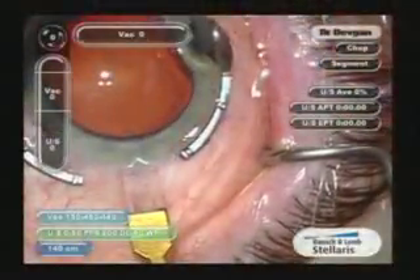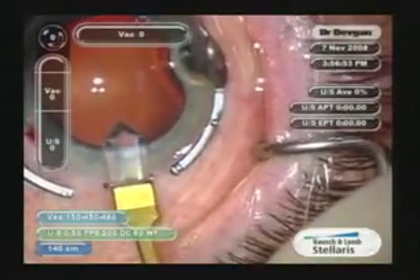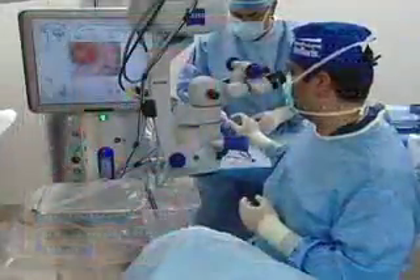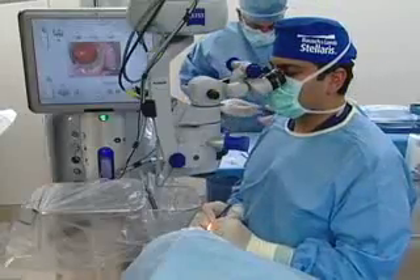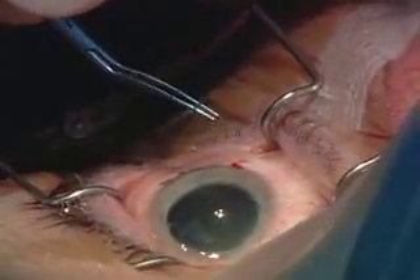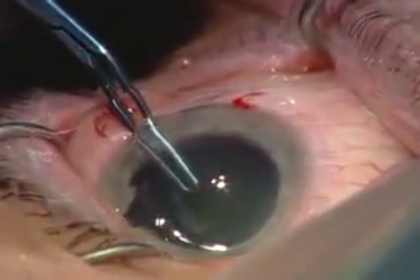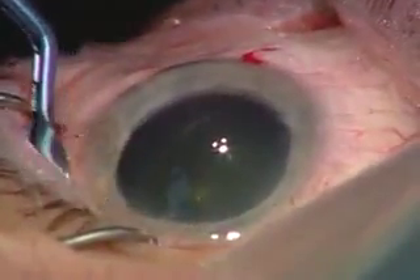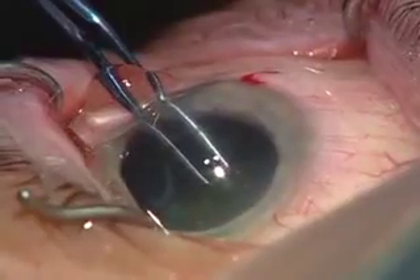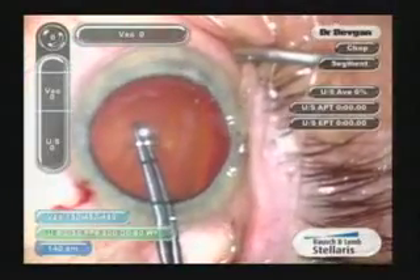Here's our main incision — this is a diamond keratome, about two millimeters wide. Someone's asking why do faco through a two millimeter incision when you're just going to enlarge it to 2.8 to put the lens in. There's a better sealing of the incision if you do faco through a small incision and then slightly enlarge it. Here's our capsular forceps — ease on in here. These have sharp tips so I'm able to just poke in; I don't use a cystotome.